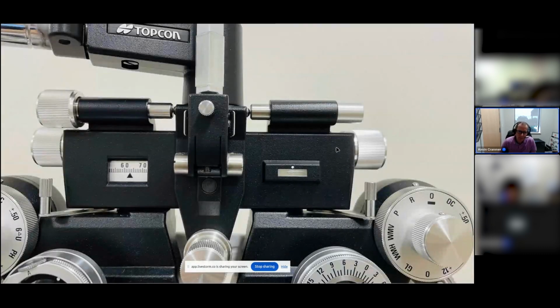Okay, great. So there are two knobs that you see also. Not sure if you can see my pointer here, but there are two knobs on the left side of our picture. The top one, when you rotate that knob, will level the phoropter. The phoropter will tilt back and forth because, again, you're measuring the astigmatism and it has a direction. It matters that the phoropter is level. There's a small bubble level on the right side of our picture here, and you can rotate that knob so that the bubble becomes centered below that white dot.